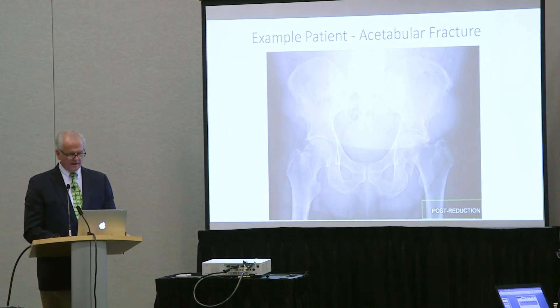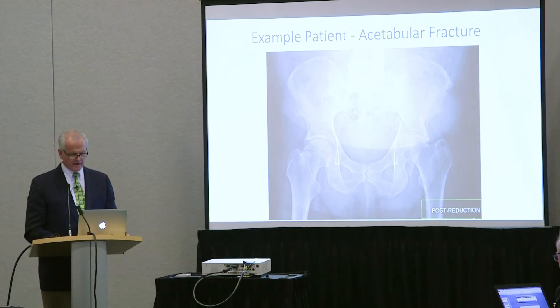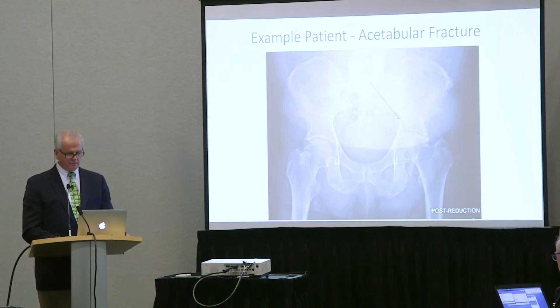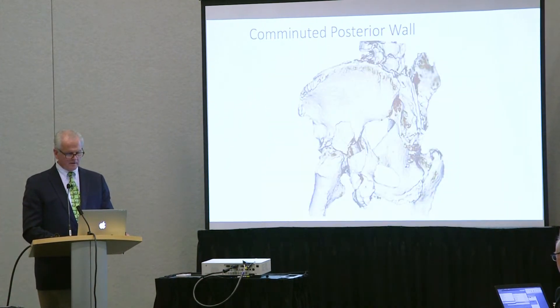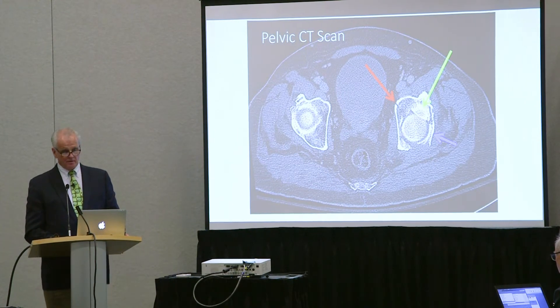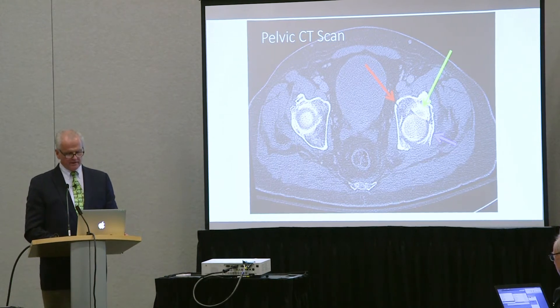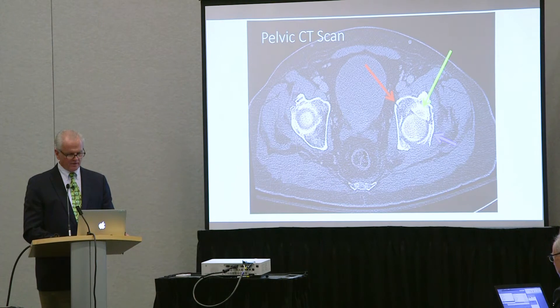Here's an example — an acetabular injury. You can see it's a fracture dislocation, and there's been some attempt at a closed reduction. This is his transverse component, this is his intact dome, and this is the displaced wall. It looks like this on a 3D — you can see the wall is in several components and the transverse displacement. On CT scan, you can see there's not a lot of dome for the head to stay on, and for that reason he continues to be subluxated away from the intact dome.